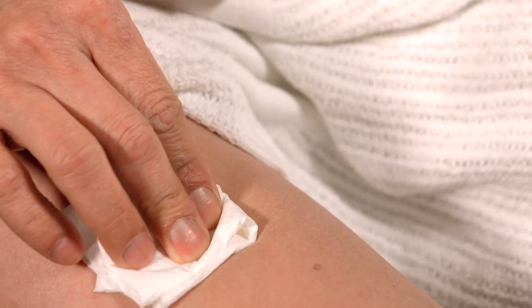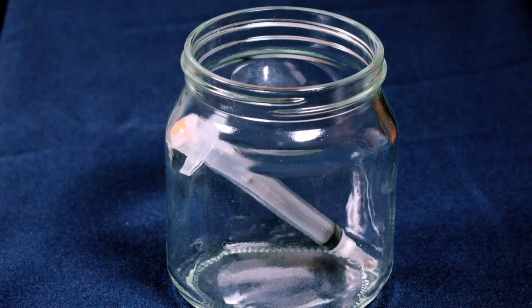Press down gently onto the injection site until any bleeding stops. Dispose of the needle safely.